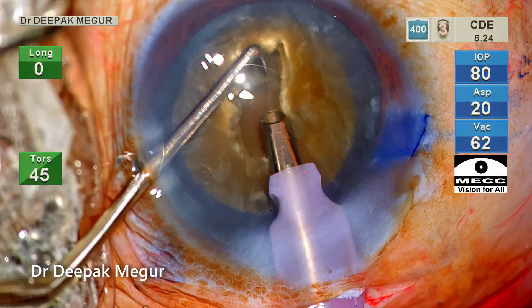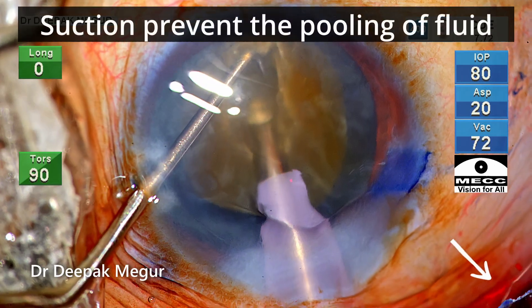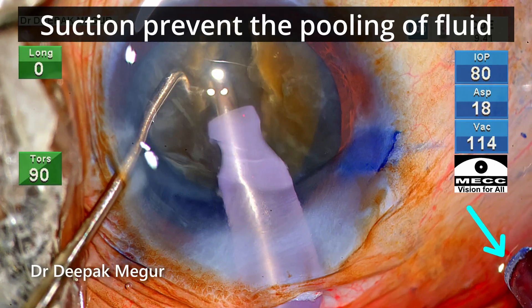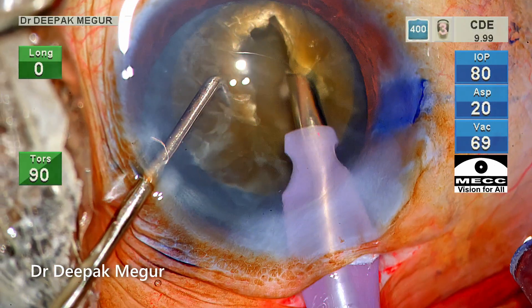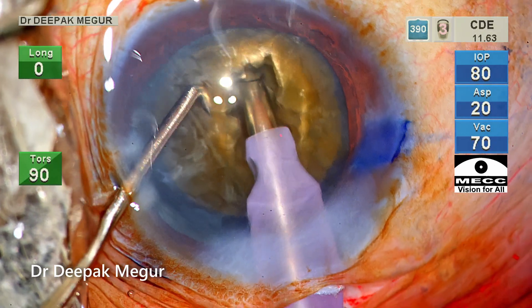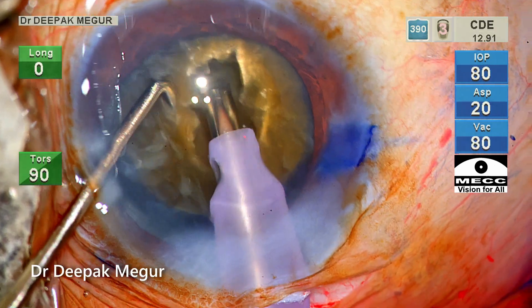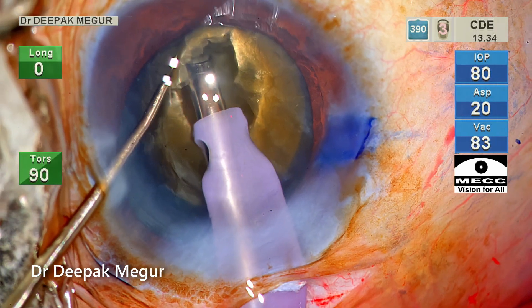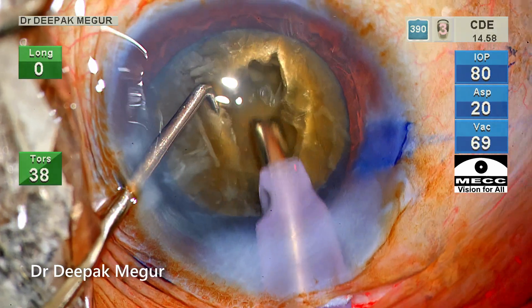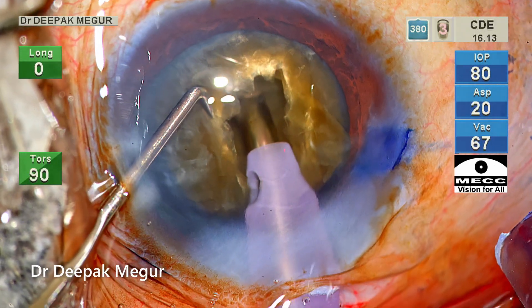Because this is a deep-set eye, there is going to be some pooling of fluid, and my assistant is using the suction machine to aspirate some of it out. As you can see while sculpting, there's a glimpse of the pooled fluid. It's important that we address these basic issues — whether my visibility is good or not — it's not just about focusing on the current step. We need to ensure that the conditions are conducive so I can see well.